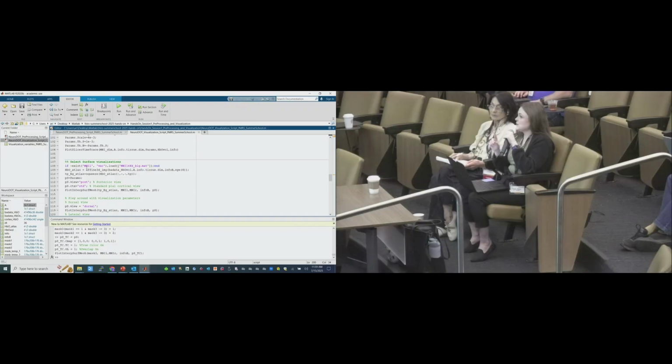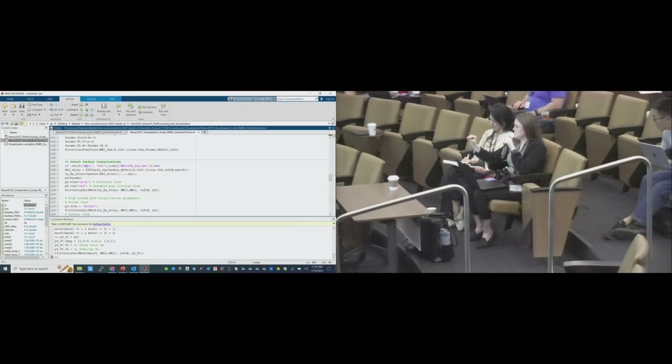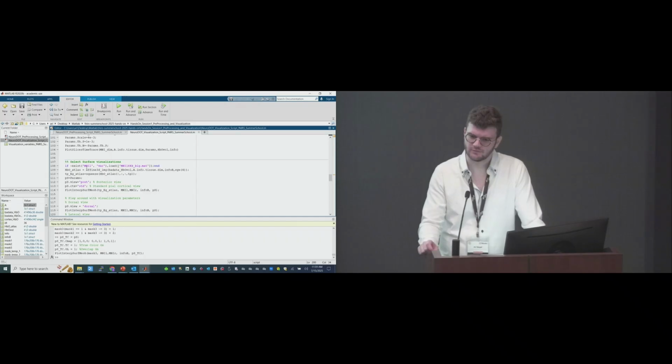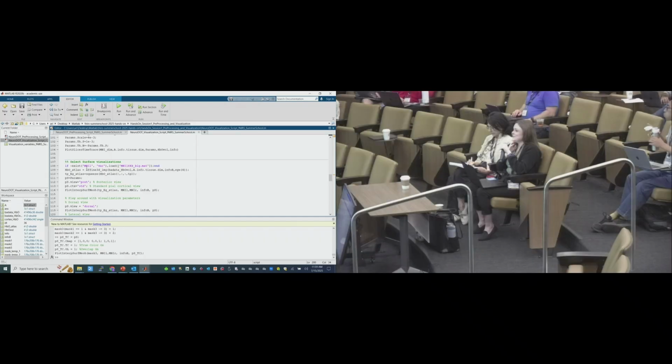Okay, and for those who don't have fMRI, is here the only time where we would put in some atlas stuff, or would we do that in those other reconstructions too? Could you rephrase the question? I'm not sure I understand. It might just be me not having ever done the image reconstruction scripts. Gotcha. Yeah.